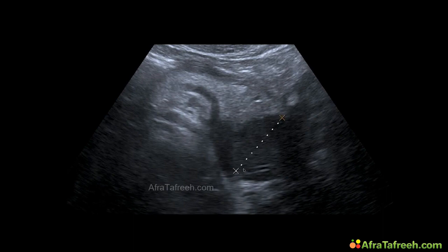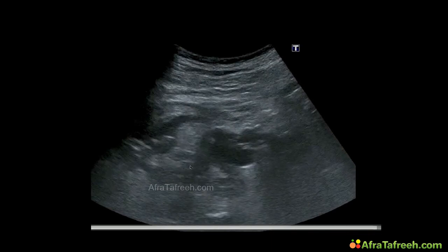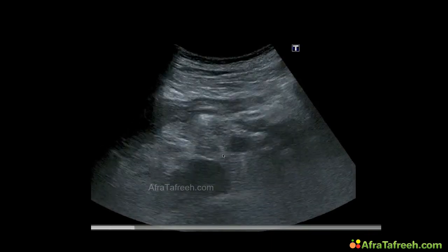It exceeds 4 to 5 centimeters, and especially cancer of the pancreas is killing nearly all patients because the symptoms are various, there are no early findings, and the patient shows up in hospital with an advanced stage of cancer. Sometimes the tumor is hard to find, and we will not be able to improve the prognosis for this particular patient, but save a patient's life using ultrasound. Sometimes we are able to save someone's life.